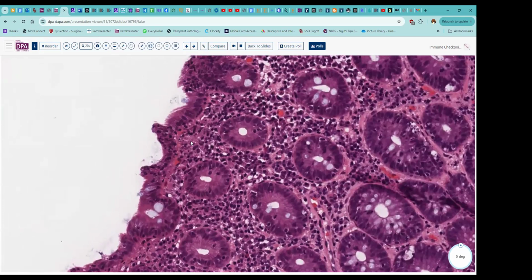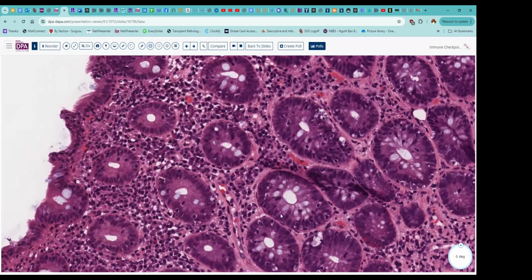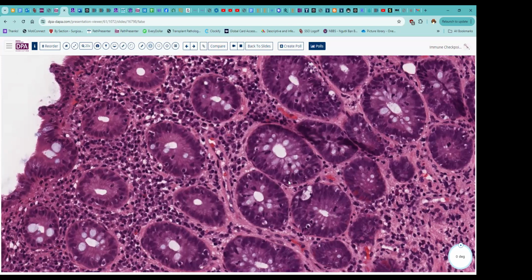Now, as you know, that comes in several flavors. There's kind of a lymphocytic colitis where you've got the more prominent lymphocytes throughout the epithelium. And this does have maybe an increase in lymphocytes here in some of the areas of this epithelium. You can see down here, there's more than one lymphocyte nucleus per 5 enterocyte nuclei.